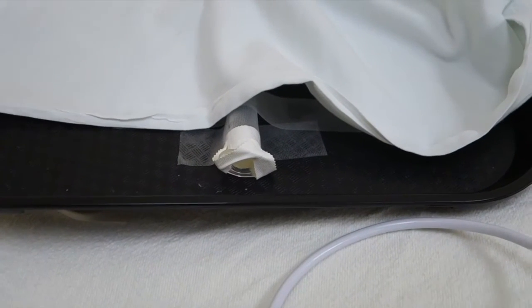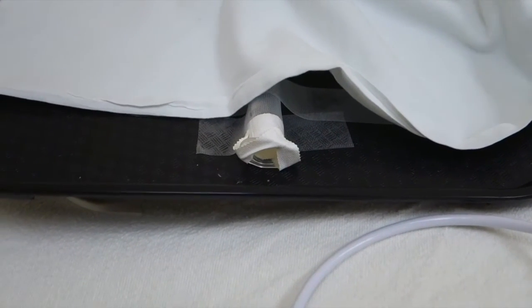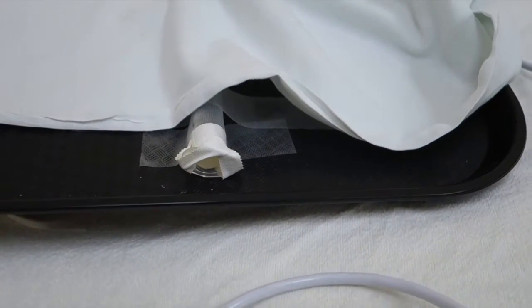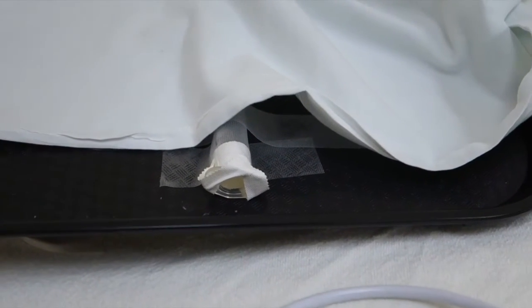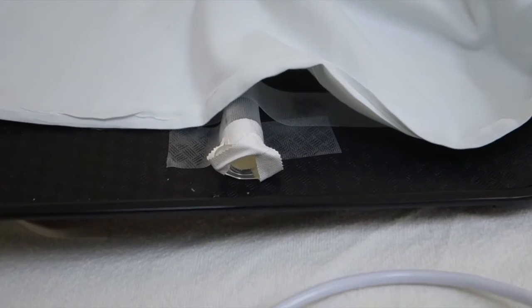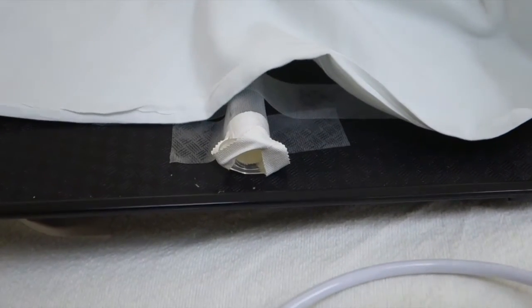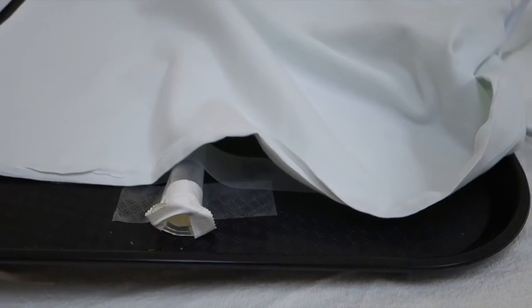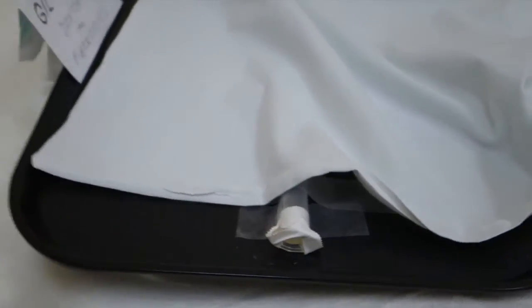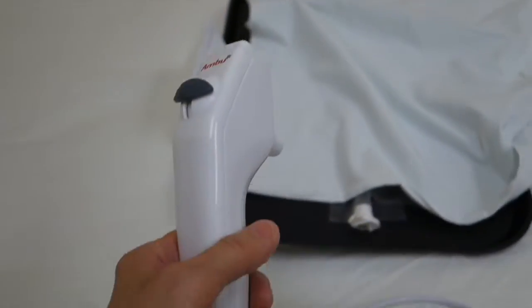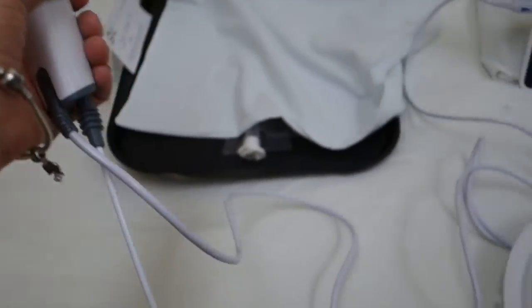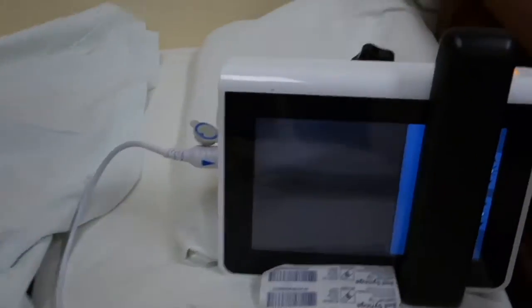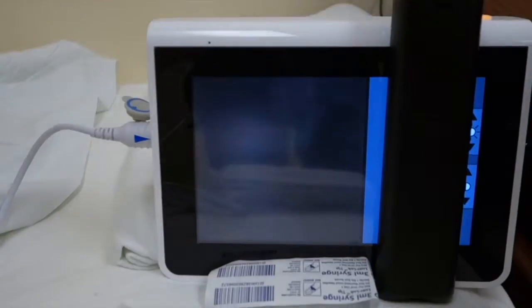Always leave out the vocal cord area so you know where to enter. Hand positions should be identical to those in clinical positions. It is easier to sit down if the model's on a table, or if it's higher up, then you can stand.